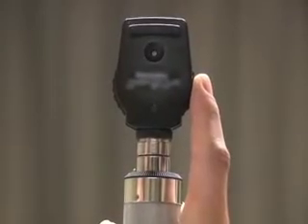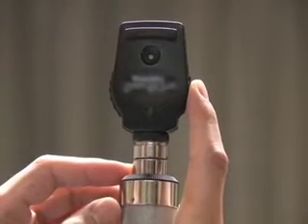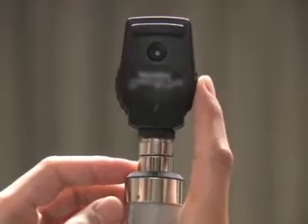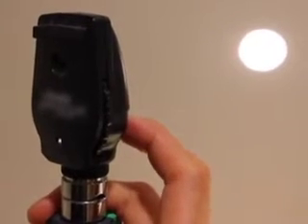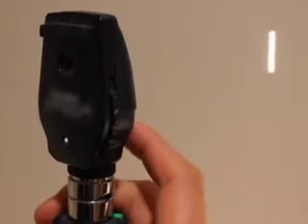The direct ophthalmoscope consists of a handle, which contains the power supply and a light source, and a head, which contains the viewing window and lenses. The on-off switch adjusts the brightness of the light. The apertures include a large circle, a medium circle, a small circle, and a slit beam.